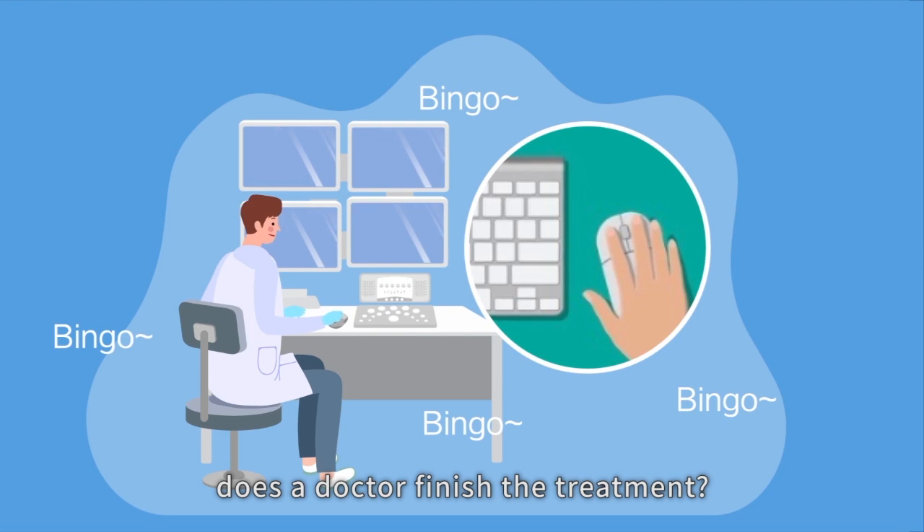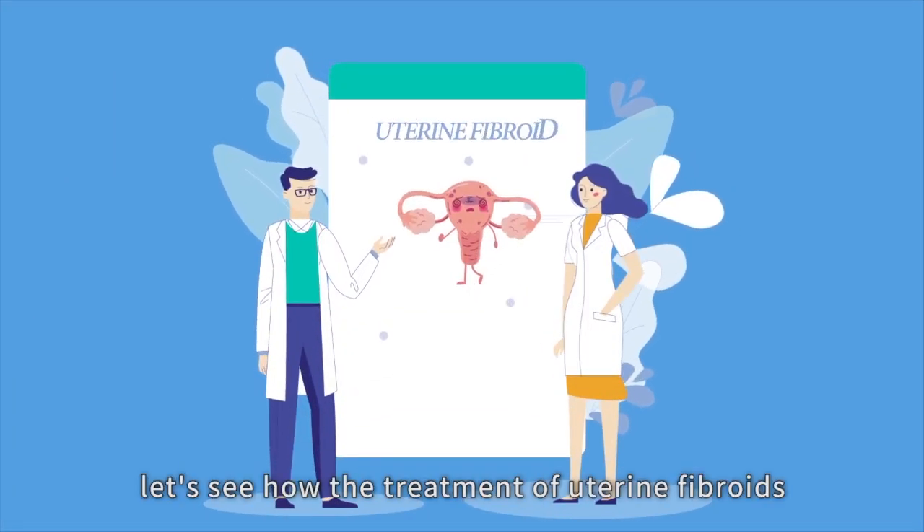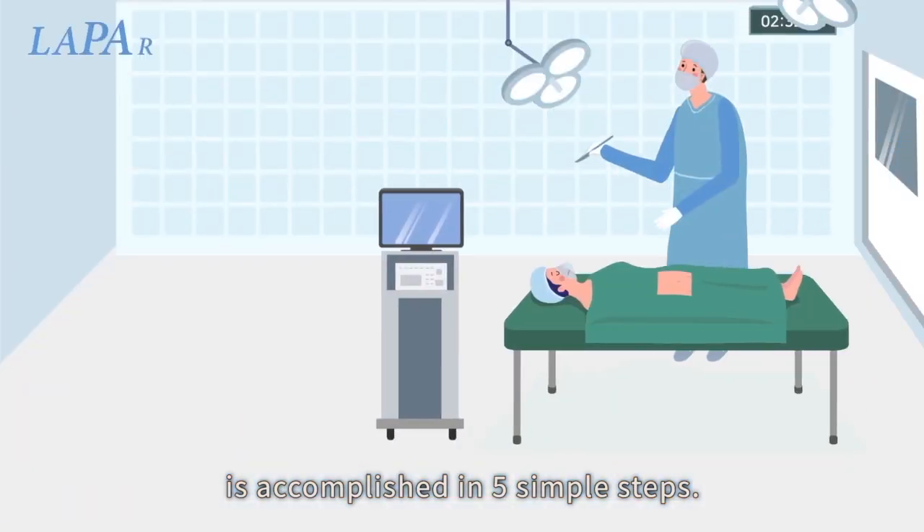By a few clicks of the mouse, a doctor can finish the treatment. As an example, let's see how the treatment of uterine fibroids is accomplished in five simple steps.